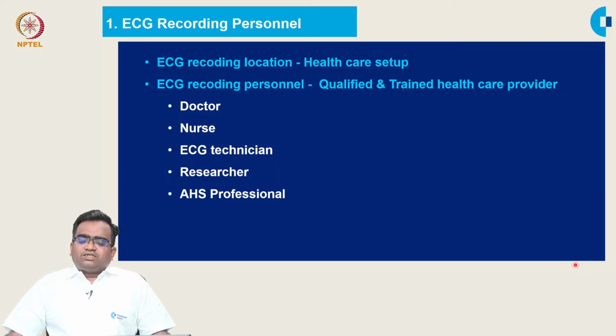First, we are going to see the ECG recording personnel. ECG recording has to be done only in a healthcare setup. The ECG recording personnel must be qualified, trained and expert in the recording techniques.